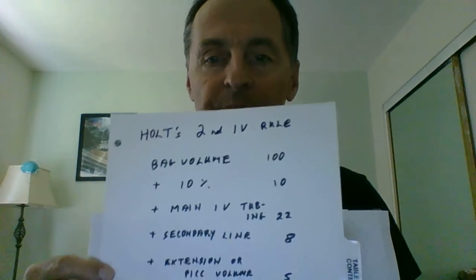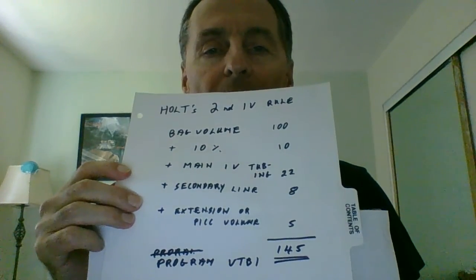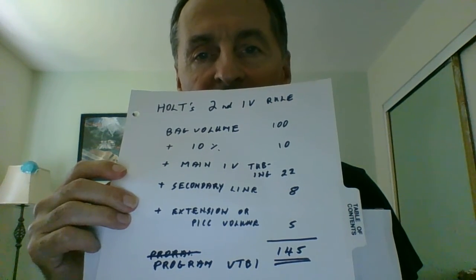Because there's about a 10 cc overflow in each 100 cc bag, you're going to leave 10 cc's in the bag, and you're going to leave the entire IV tubing full of antibiotic, plus any extension which may be between the setup and the patient. This is shown in my second graph, brilliantly set up this morning, which shows that you need to take account of all the dead space.